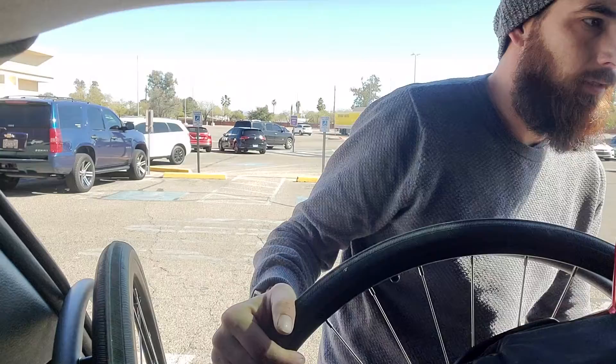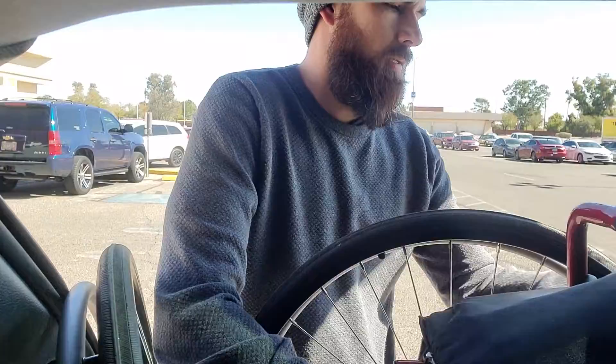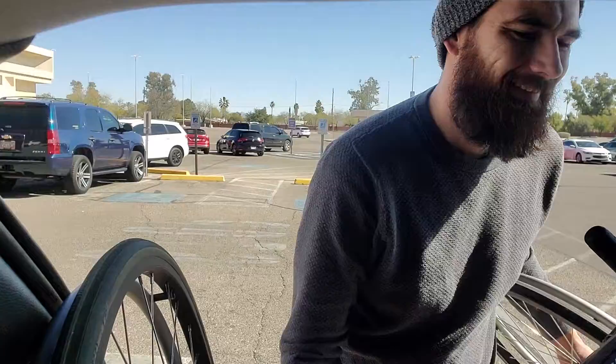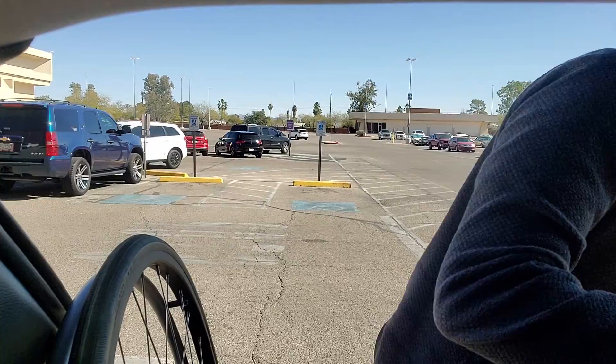Then remove or release my — damn, if I had a smaller box it would work just perfectly right here, would be a lot easier. You release the breakdown, put the other wheel in, and that's it.